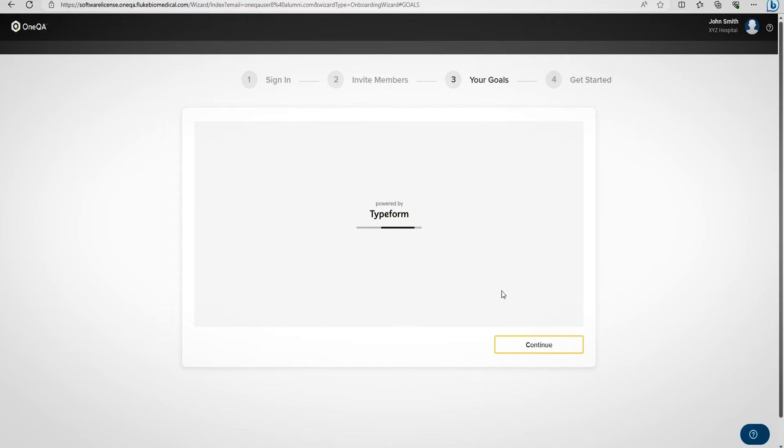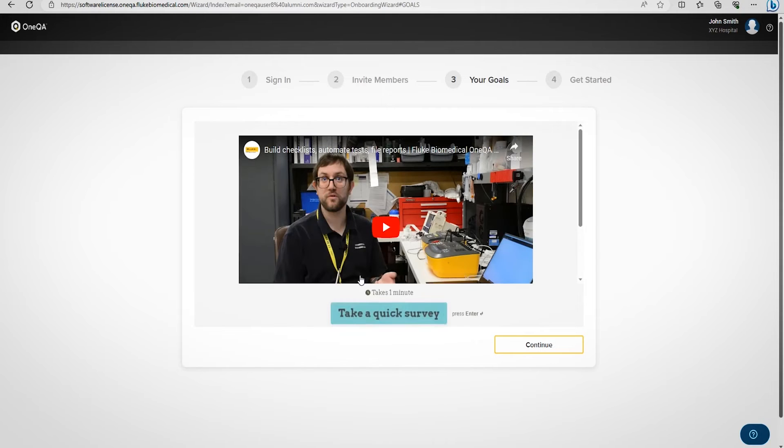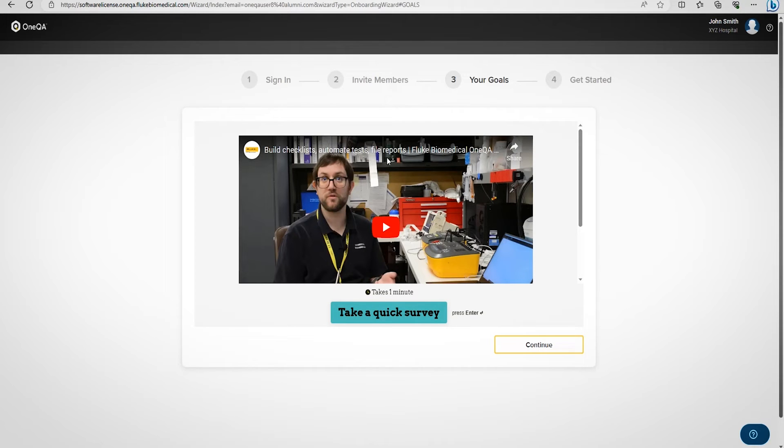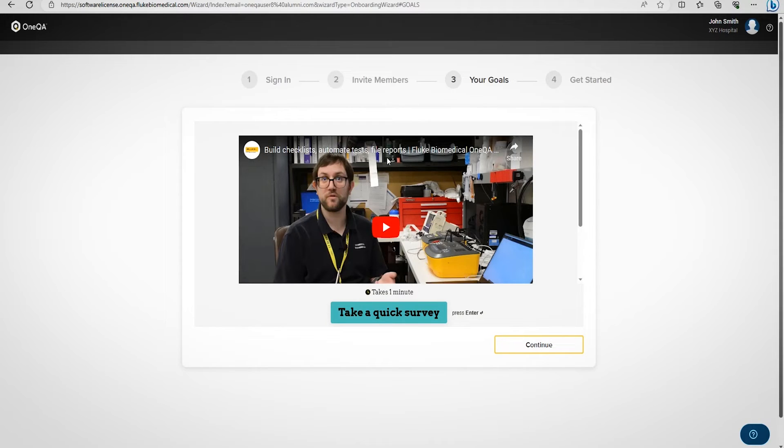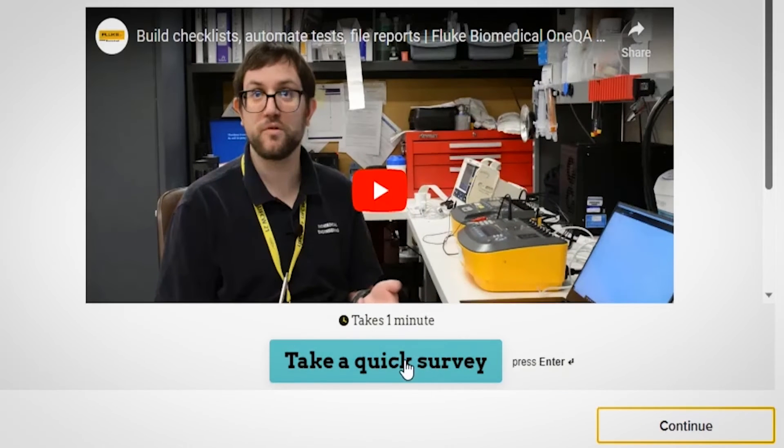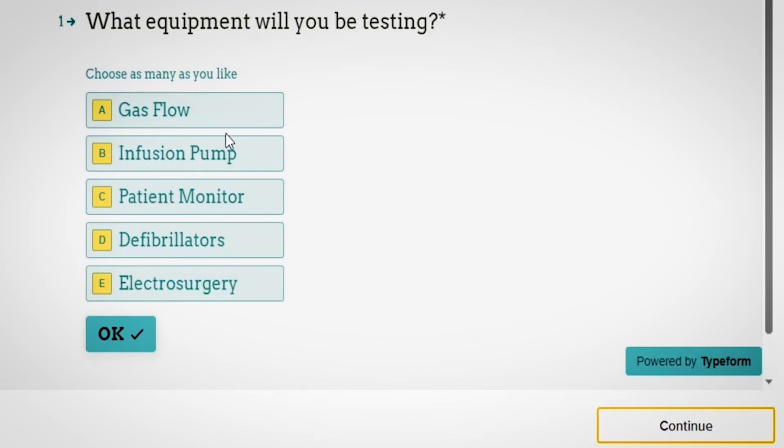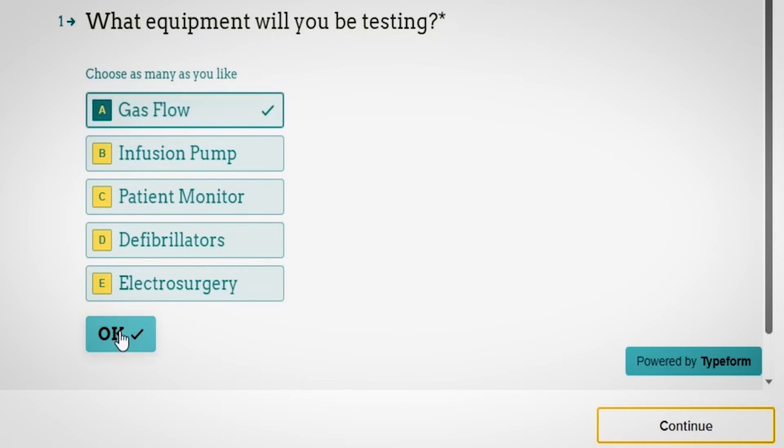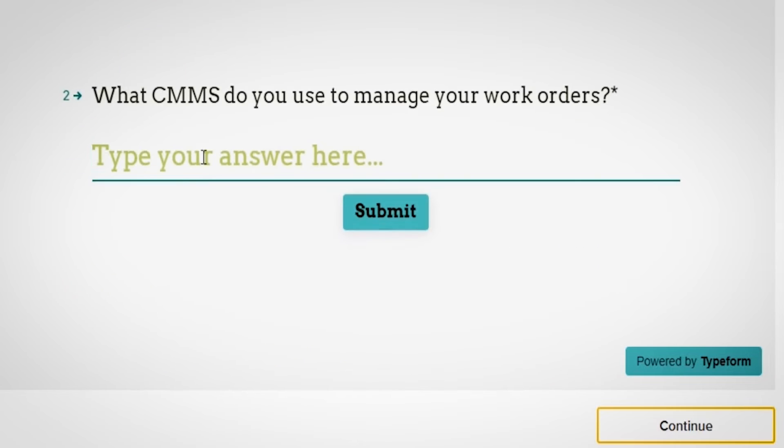There's a helpful OneQA video that explains what OneQA is, how to automate tasks, build checklists, and file reports. The video is approximately one minute long, so you can watch it as part of this process or choose to skip it. You can also participate in a quick survey by clicking Take a quick survey. This survey contains a few questions that Fluke would like to ask its current customers for feedback.